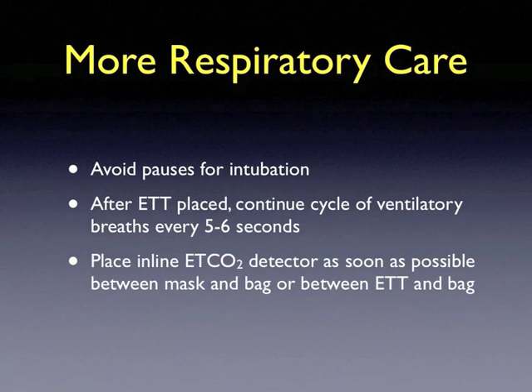Okay, let's discuss the last couple of points on respiratory care in cardiac arrest. You want to avoid long pauses for intubation. A good airway manager should be able to intubate the patient successfully during active chest compressions without long pauses. A short, less than 10-second pause is okay if you're just trying to pass the tube in that case, but you want to avoid the 1 to 2 minute looking at the airway, passing the tube, reattempting to pass the tube, successfully passing the tube, inflating the cuff, assessing for correct tube placement that delays the definitive treatment of the patient in a pulseless state, which is continuous chest compressions.